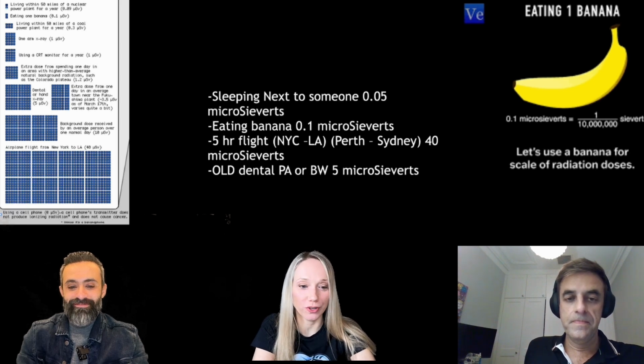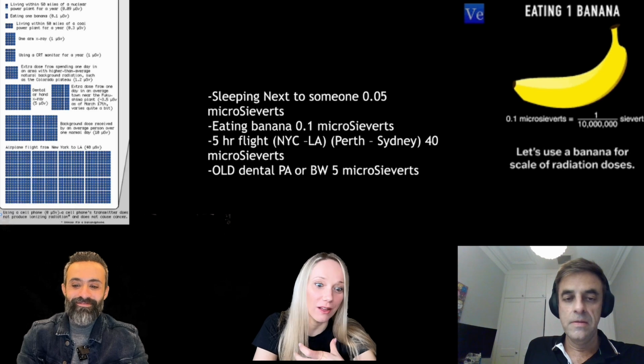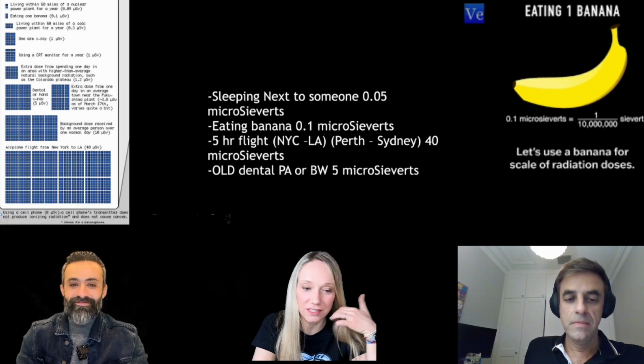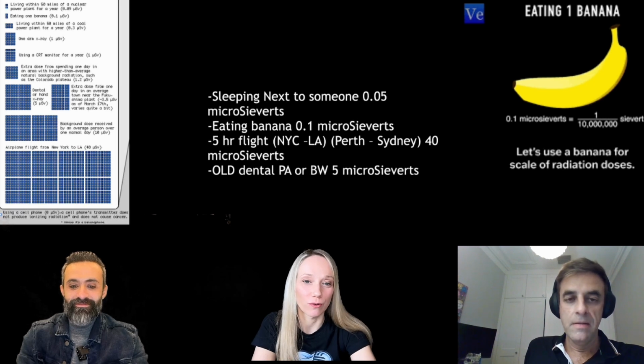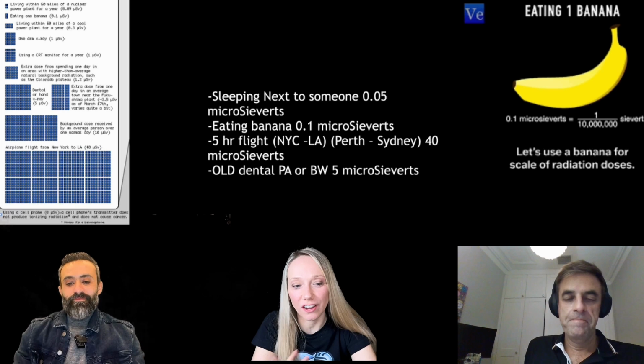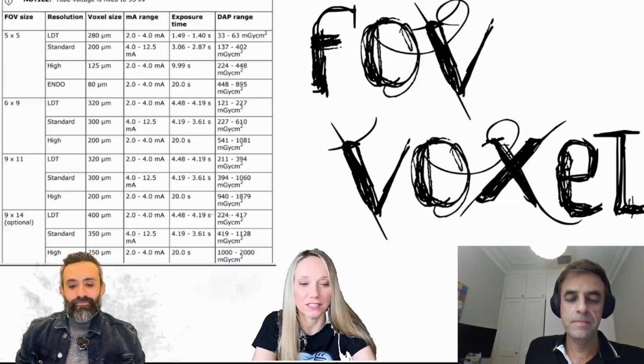Also, the way in which you can present to the patient the amount of radiation comparing to something that they really know, I think it's very easy for you in the communication process to make them understand what they are going through. So it's very nice.